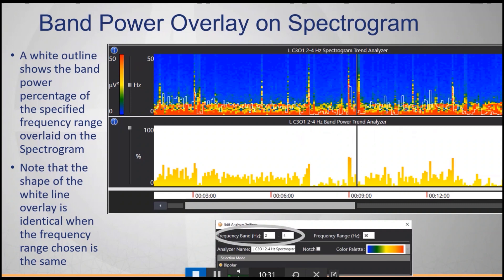Here's an example: in the analyzer settings, the frequency band is set to 2 to 4 hertz, and the band power trend analyzer is set up the same way so you can see what the white line represents. It is exactly the same thing as the band power — it's simply overlaid on top of the spectrogram so that you can compare the two to each other.